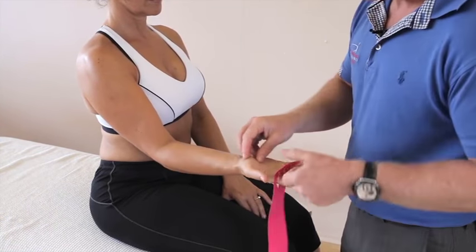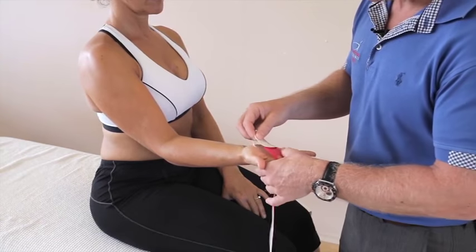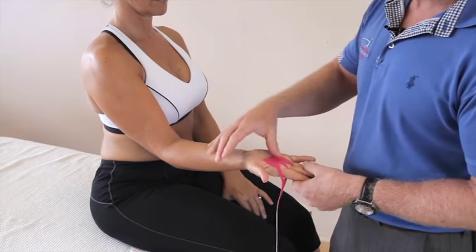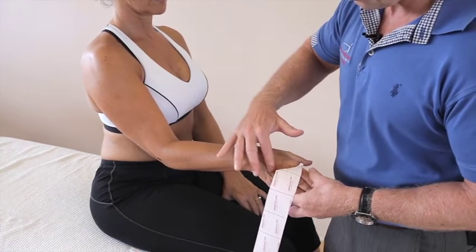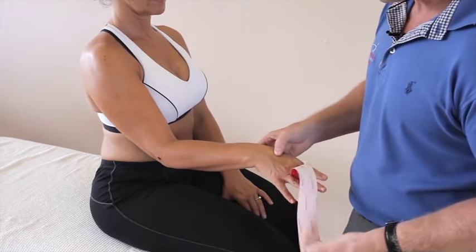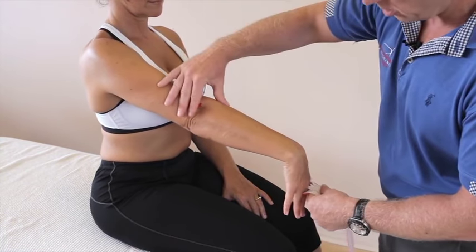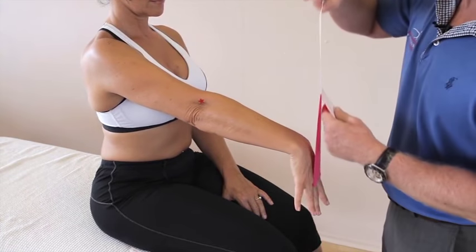Turn your hand over please, then literally just feed it out. If your hand gets sweaty or gets wet through kayaking or rowing, you might want to apply the tape on top without the cut-out. From this position, straighten your elbow and flex your wrist — this is the position to pre-load the actual extensor tendon.